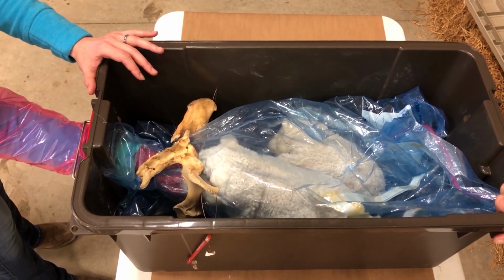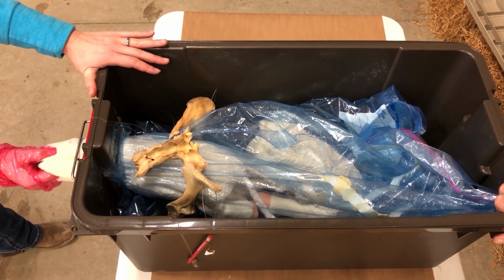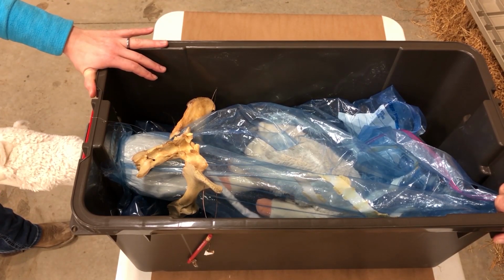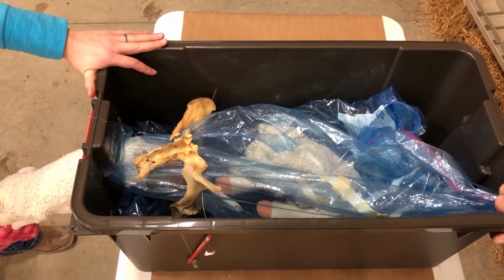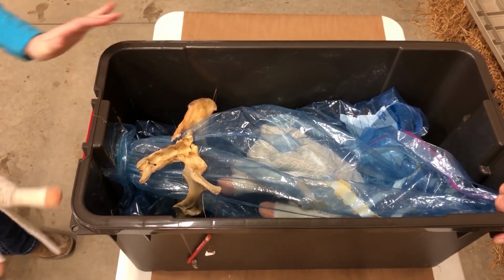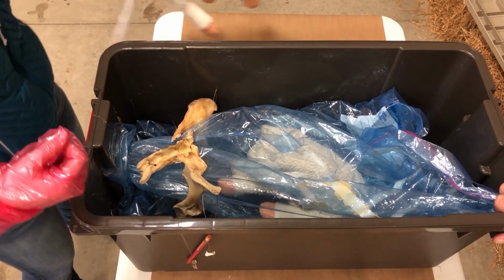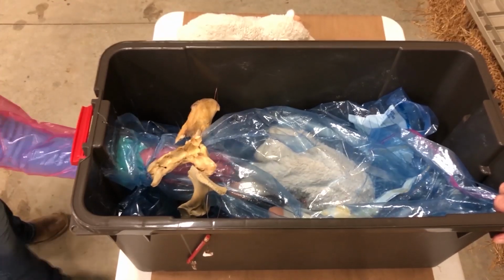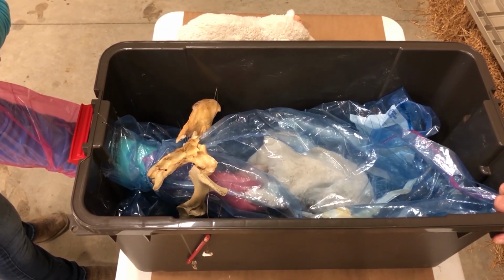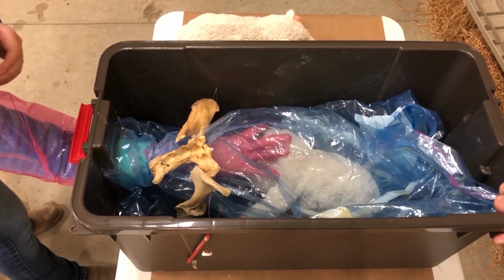I can then start to pull and deliver this first lamb normally through the pelvic canal, through the cervix. Once I've got it out past the shoulders, past the rib cage, then I start pulling down towards her feet, wherever the ewe's feet may be at that point in time. Obviously I have a second lamb in there, I already know that. So I'll go back in, I'll get the first 2 legs and the head, and then I can deliver this lamb normally.